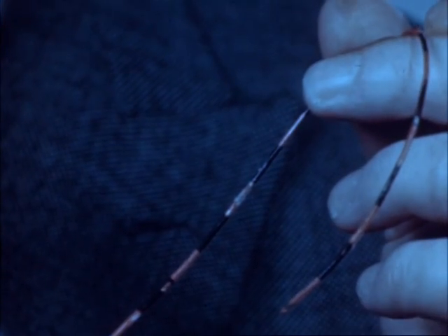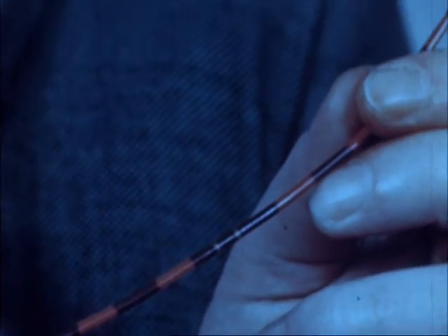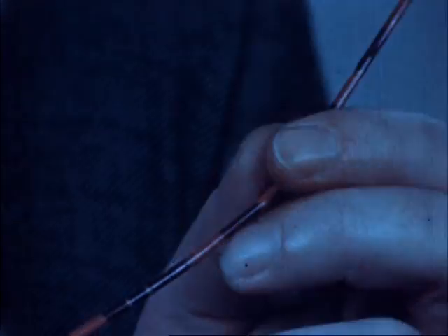He then walked to the X-ray room and arranged a mirror in front of the screen so that he could follow the passage of the catheter into his own heart. Here is the actual radiograph taken at the time. He felt nothing and there were no ill effects. "Later on, I passed a thicker catheter. And on 2 occasions I tried to obtain pictures of my heart outlined by radio-opaque injections."